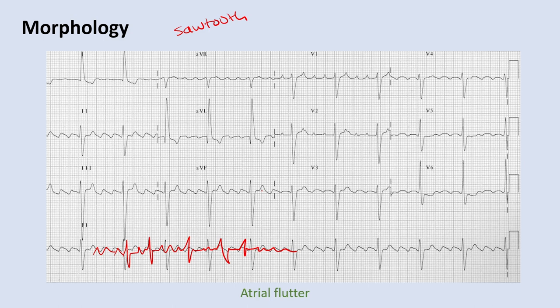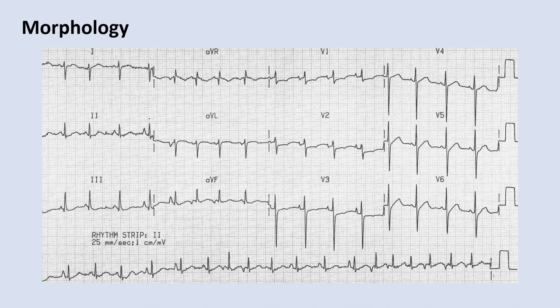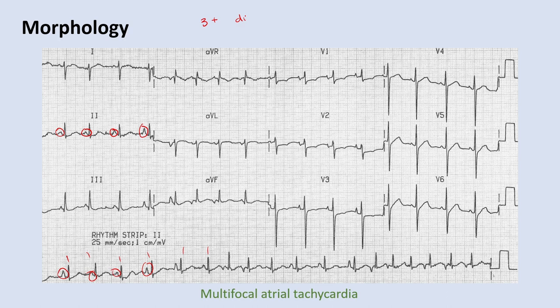This EKG shows really huge P waves, but then looking more closely, all the P waves have different morphologies — an irregular rhythm with multiple P wave morphologies. This is called multifocal atrial tachycardia, or MAT: three or more different P wave morphologies with an irregularly irregular rhythm. MAT commonly arises in patients with longstanding lung disease, and the treatment is to treat their underlying lung disorder.